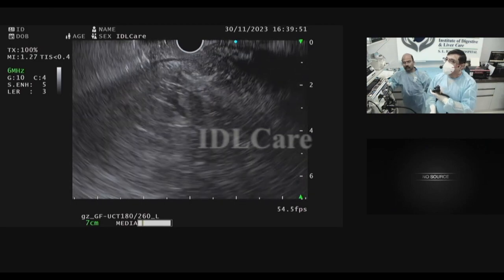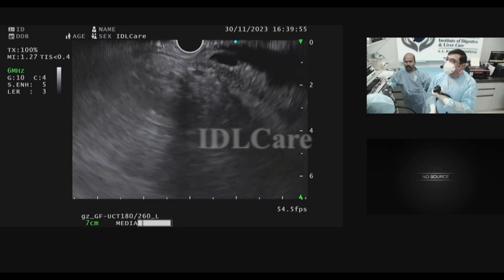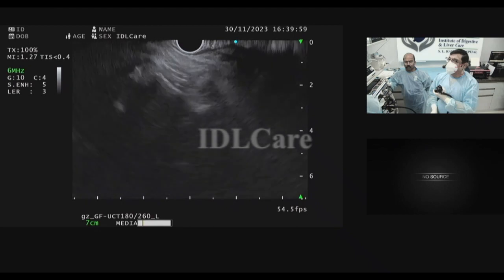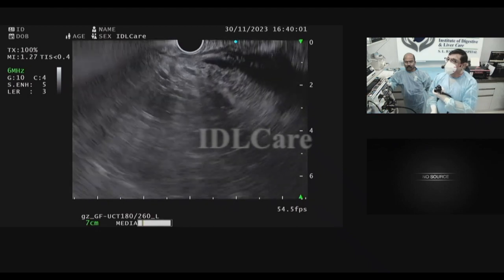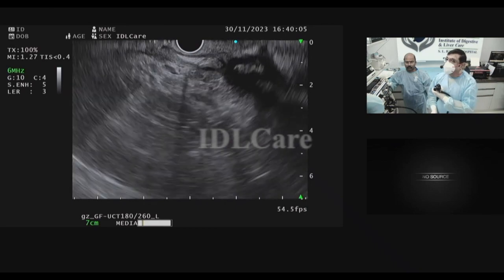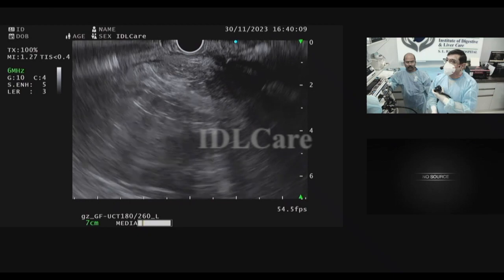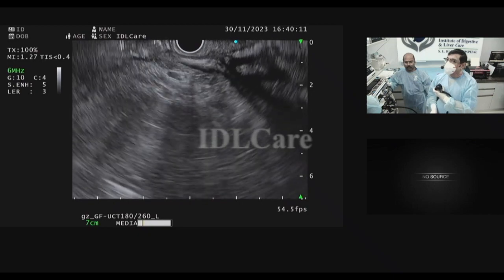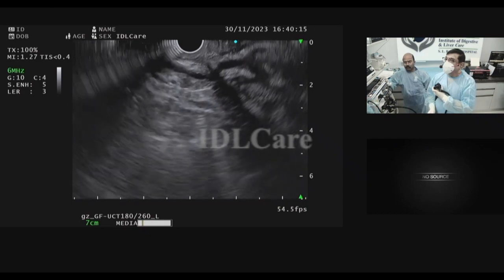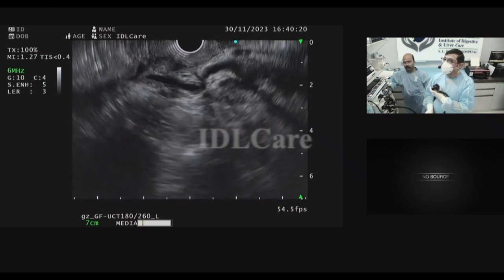And then I turn a little more anti-clockwise to see if I see the bile duct. That's the bile duct. See that? Patient is coughing a bit. That's okay. As long as Dr. Dharudkar is here, I don't bother. See, this is the bile duct. We are seeing the retropancreatic bile duct. Looks okay. I withdraw gently. Keep looking at the bile duct. See this? This is the bile duct.